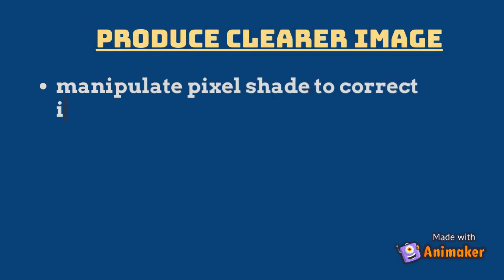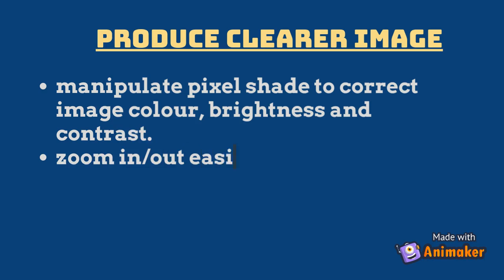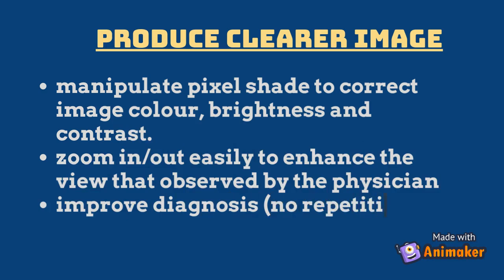One of the advantages of using DICOM is that we can produce a clearer image, as it can manipulate pixel shade, brightness, and contrast. The image can also be zoomed in and zoomed out easily to enhance the view of observation, so it will help a lot to improve the diagnosis.